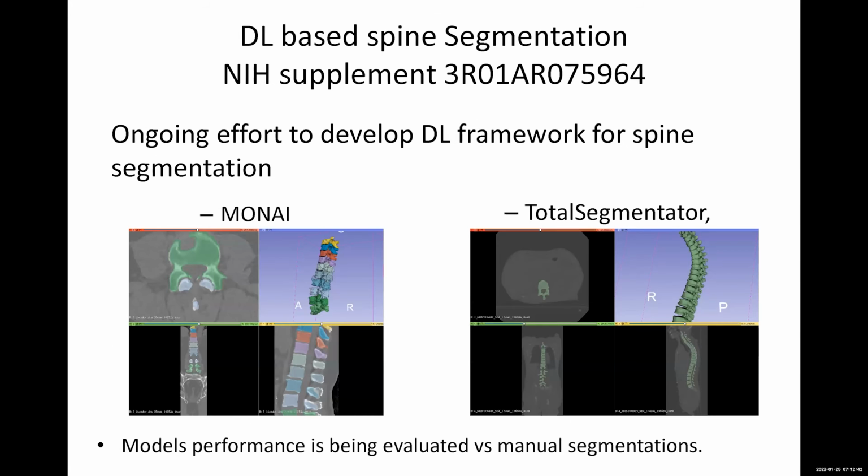And in some of the work already done, we've used MONAI and TotalSegmentator. Andres has been incredibly useful and helpful over the years, despite my total lack of knowledge of anything computers. So this looks extremely promising. And ultimately, the full spine segmentation is currently taking us about 3 minutes.